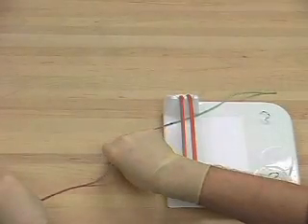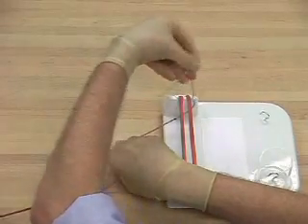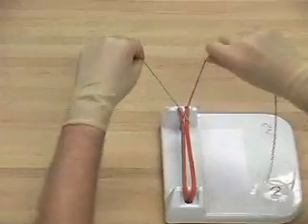A square knot can be tied using two hands, and this is particularly useful if equal lengths of suture material need to be left.